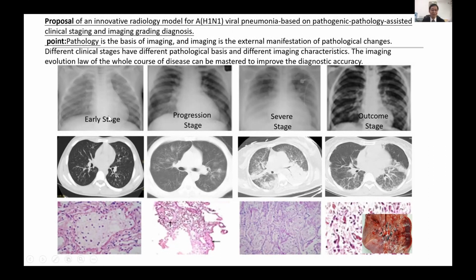You can see the early stage X-ray, CT manifestation, and pathology manifestation. The progression stage CT finding and pathology finding. The severe stage CT manifestation and pathology.